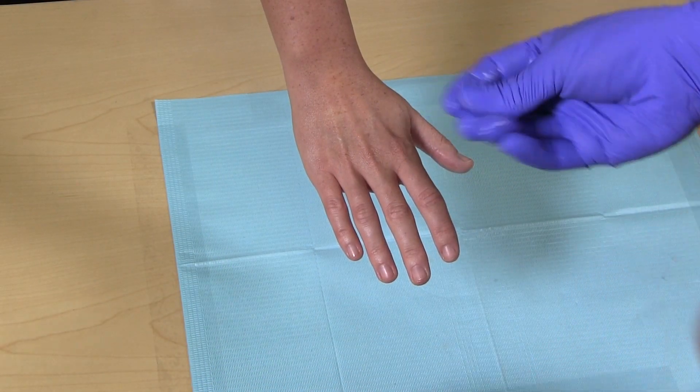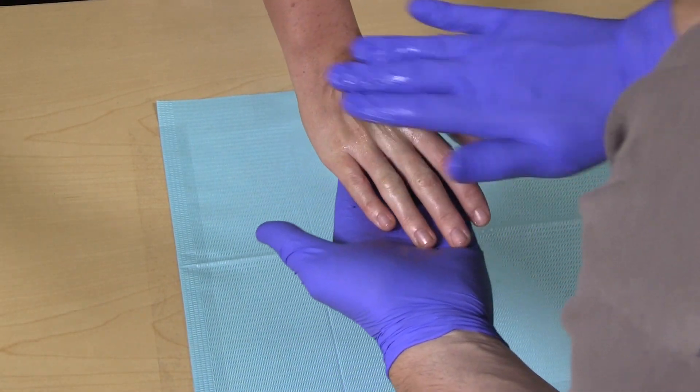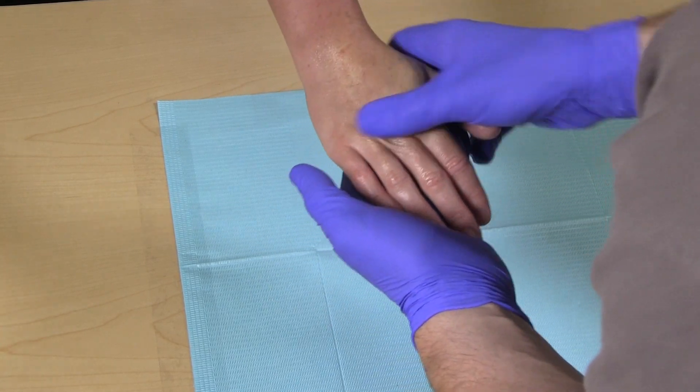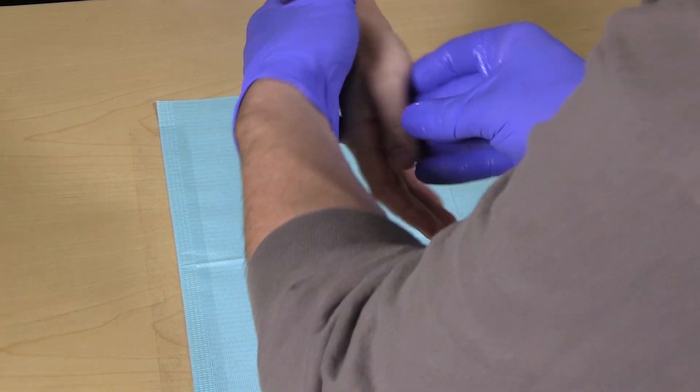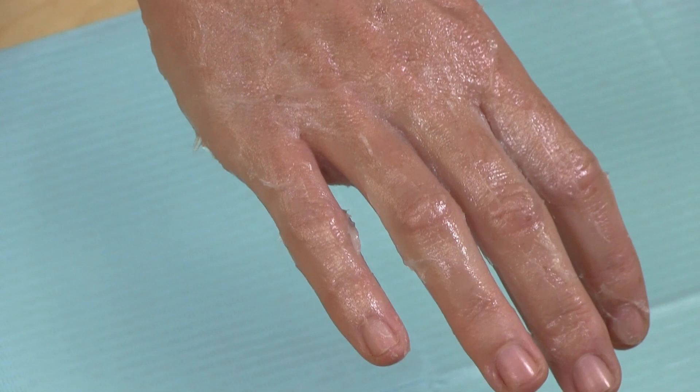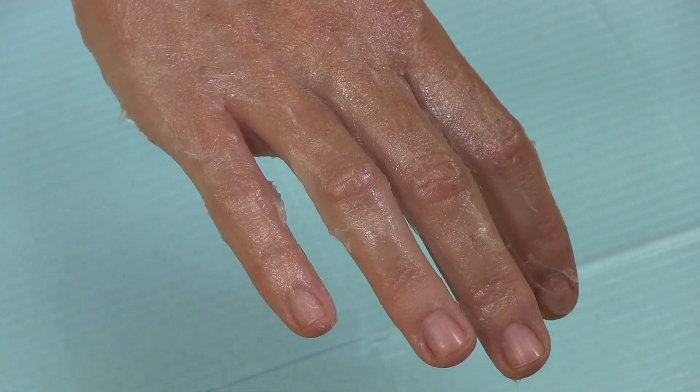Apply a thin layer of Vaseline to the customer. This thin layer is important as the Vaseline acts as a mold release after the impression material is cured. Do not leave clumps of Vaseline or a thick layer as this will destroy details in the mold.